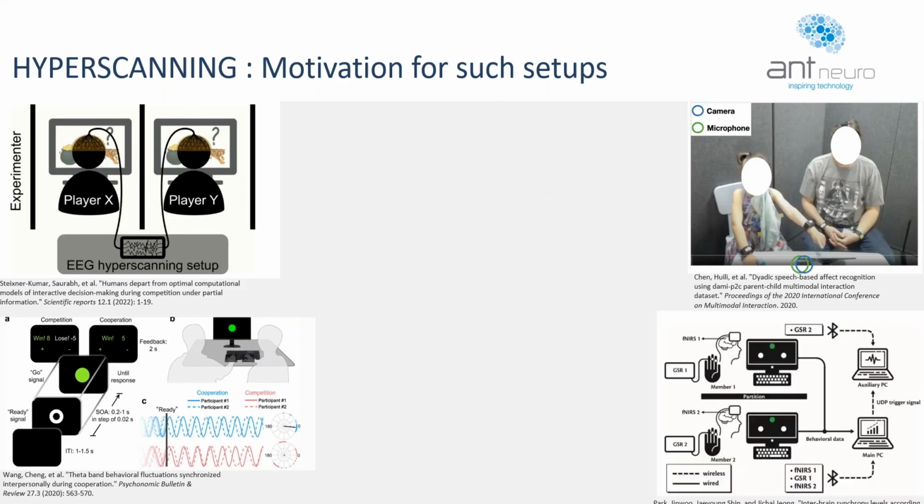Finally, I have here an fNIRS study, actually. So this is not EEG again, where they employ fNIRS and GSR as two measures to look into the autonomic nervous system. That's the part of the nervous system that is responsible for involuntary functions. The final outcome of this study shows that inter-brain synchrony is more dependent on social interactions, especially cooperation, rather than other inputs such as GSR level increase. The GSR levels were found to increase as the task difficulty level increases.